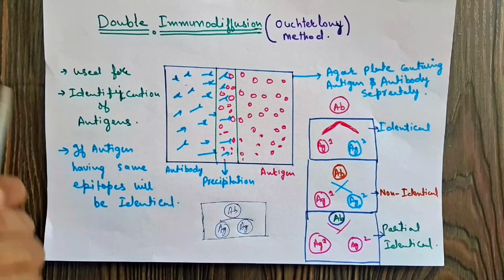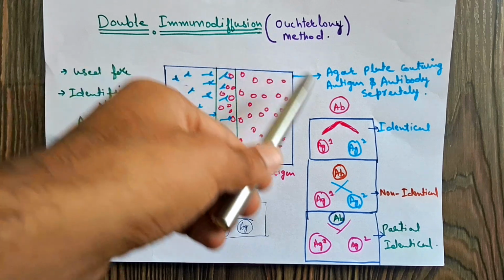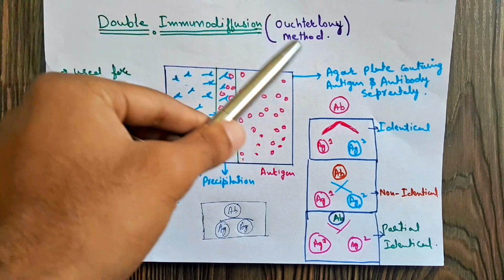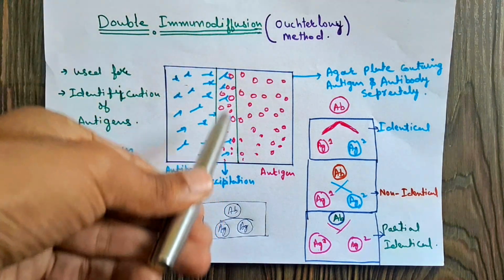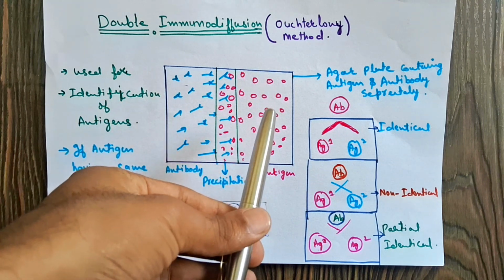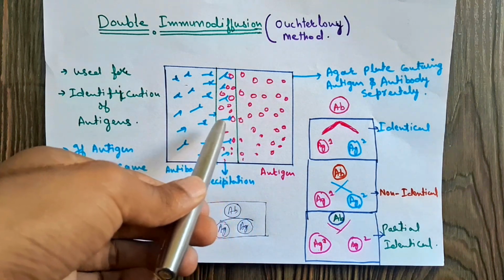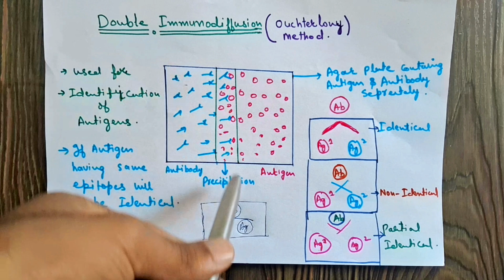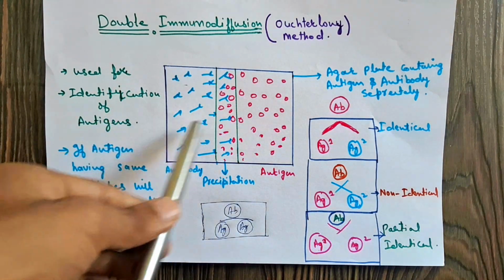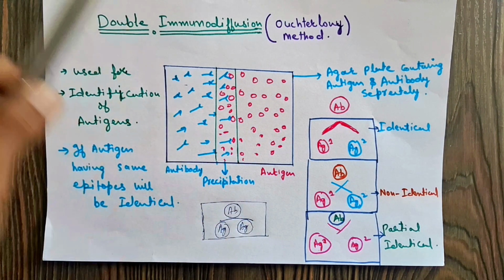In radial immunodiffusion only the antigen is diffusing, because we first distribute the antibodies uniformly on the agar plate. Here in the agar plate, in this part we add antibodies, and in this part we add antigens, sorry. Then they start diffusing toward each other at the same time, and form a precipitation here. For example, we create 3 wells: an antibody well and 2 antigen wells.